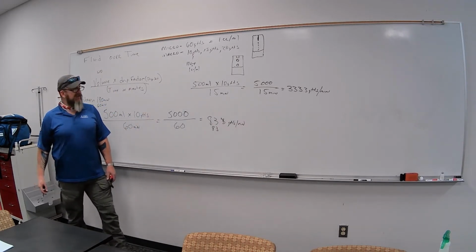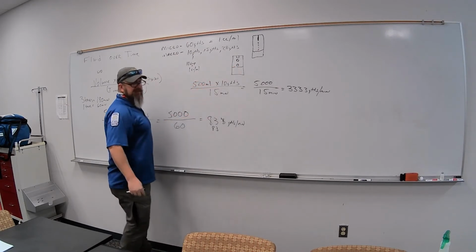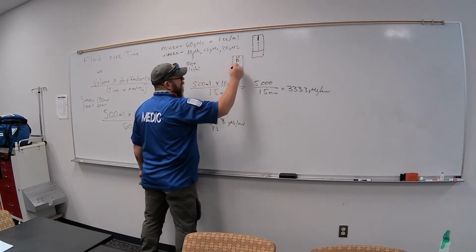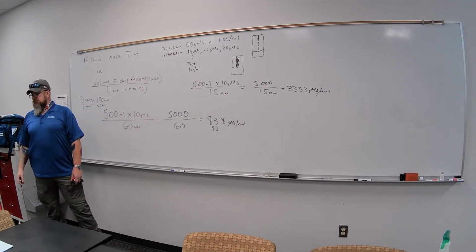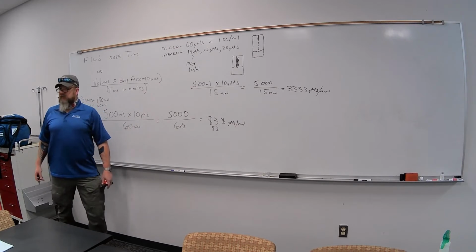So in order to give that, even in this big drop set, what's probably going to happen is this is going to look like a continuous stream, right? And you're going to be putting some pressure behind the bag to give that. Okay? If you want to give a 250 ml bolus, right? Like we talked about giving to our hypovolemic patients and that kind of thing, right? We're going to push that in pretty rapid. Okay? So the drip chamber is going to look like a continuous drip.